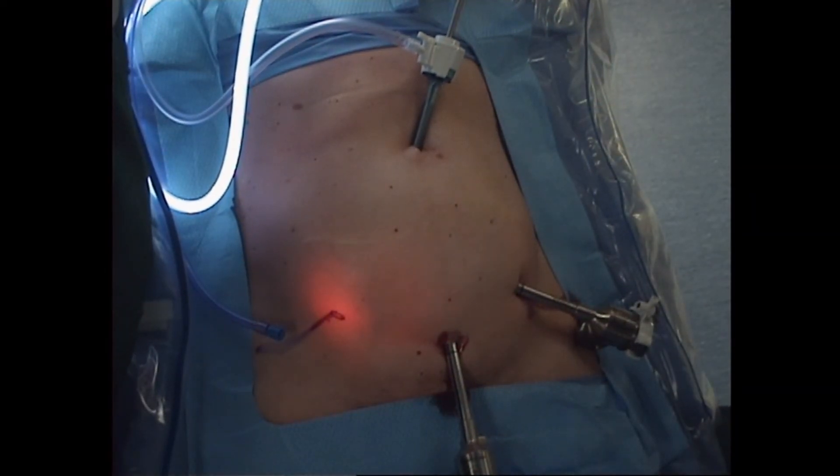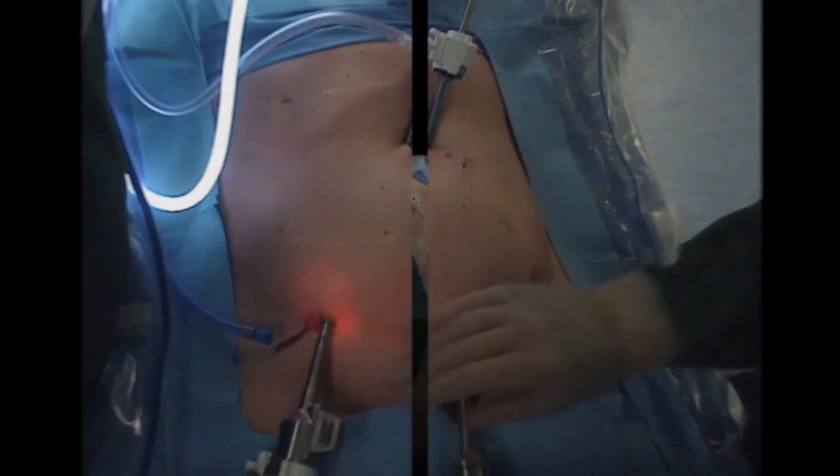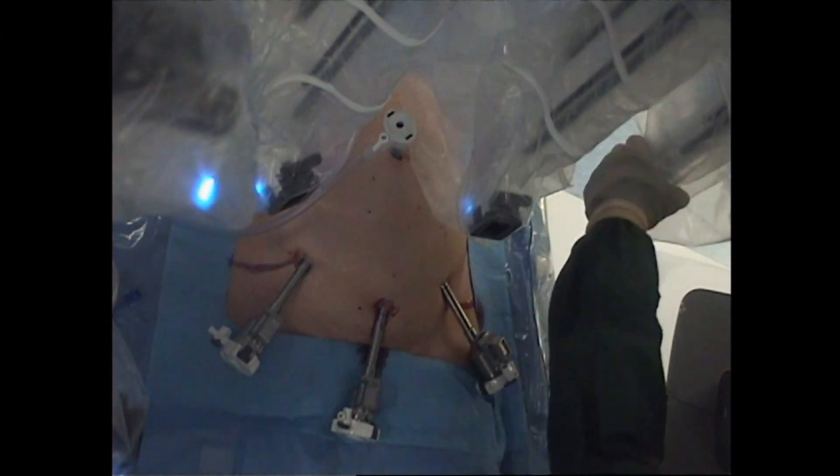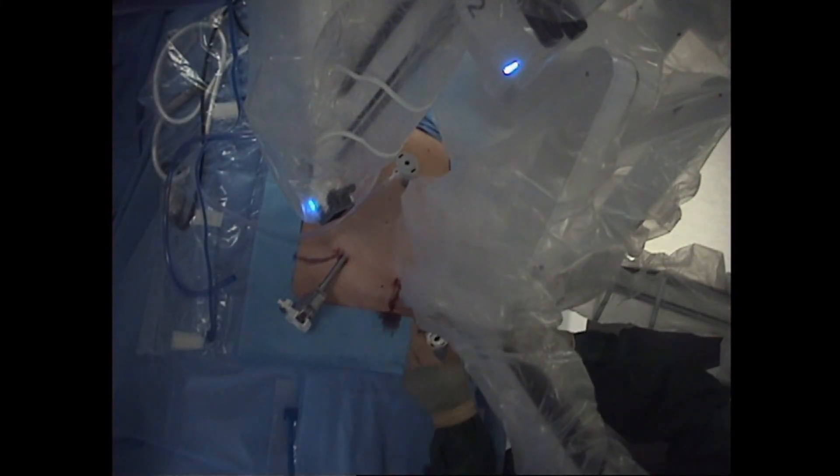The robot tower is brought up to the field and docked to the center suprapubic port. This concludes port placement for bikini-line robotic cholecystectomy.